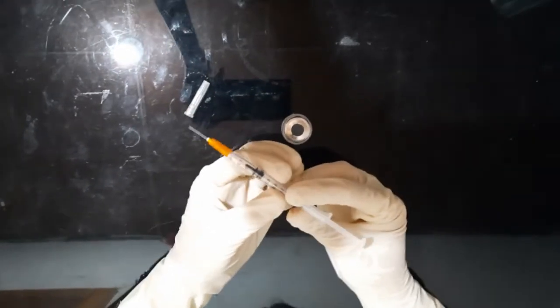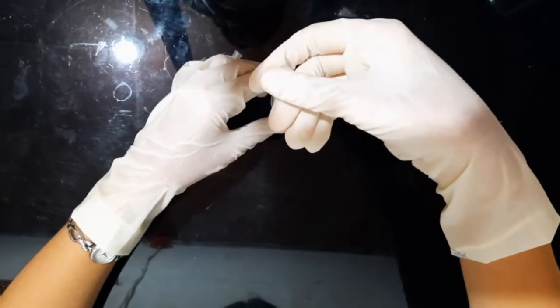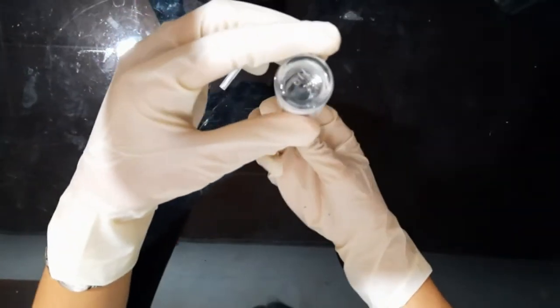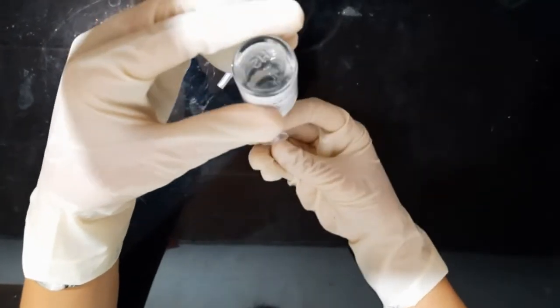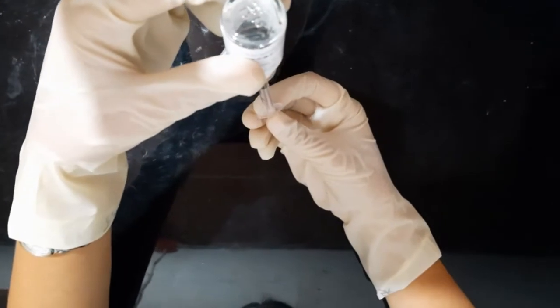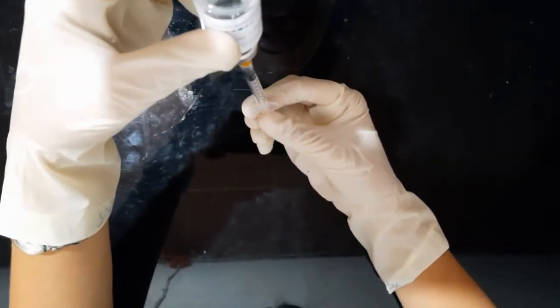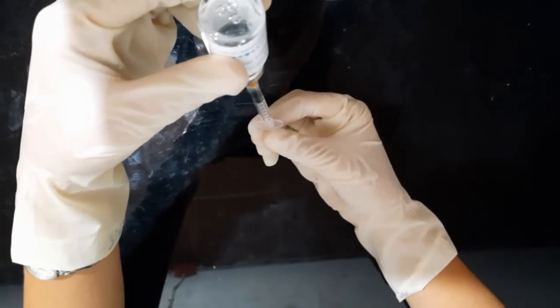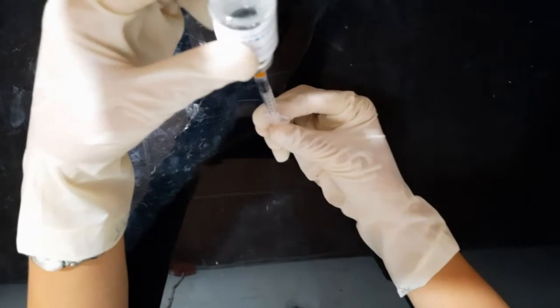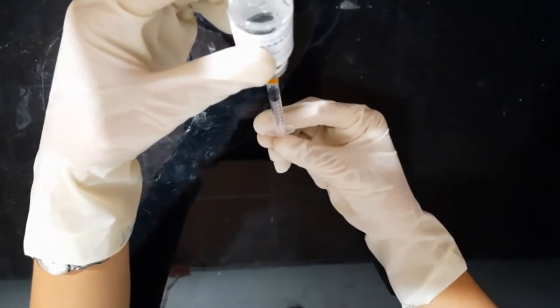We're going to inject that, and then we're going to flip it upside down and pull back 0.3 of the fluid.